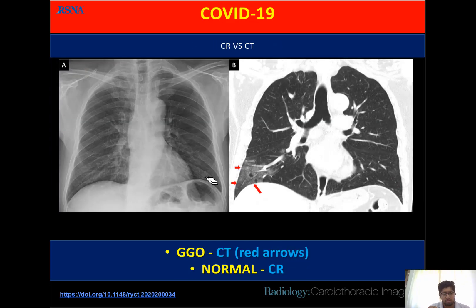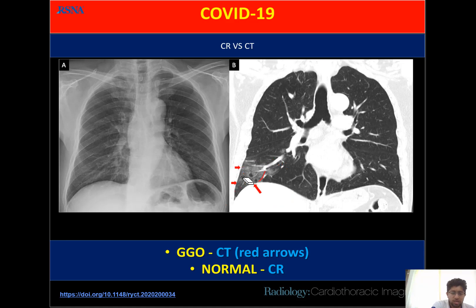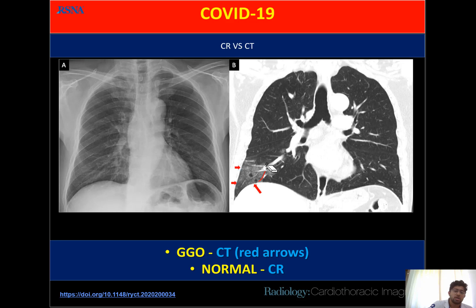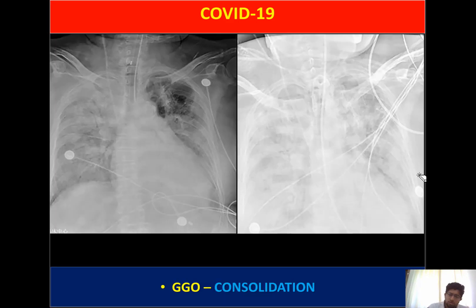Comparing chest radiograph with CT: on CT we can see peripheral ground glass opacity — whitening of the lung with vessels still visible passing through, confirming ground glass opacity with peripheral distribution. In the corresponding area on the chest X-ray, no changes are visible and it appears normal, whereas ground glass opacity is clearly seen on CT — demonstrating that CT has greater sensitivity compared to chest X-ray.